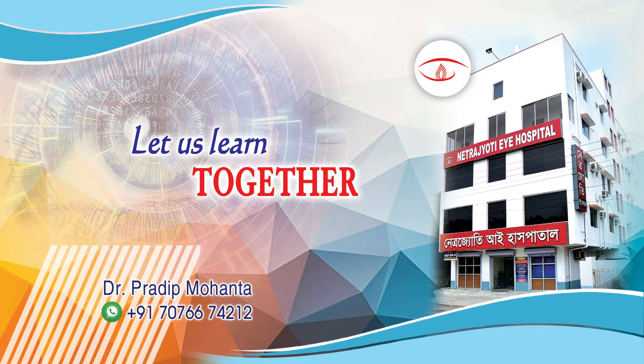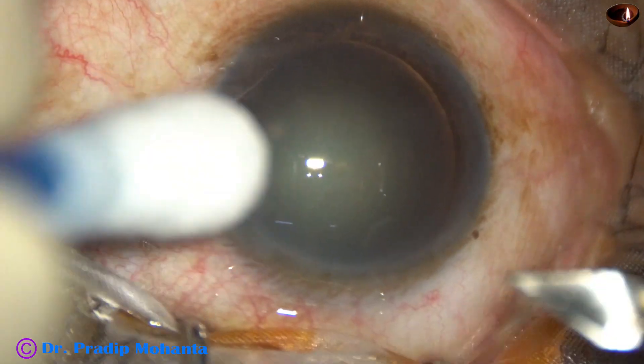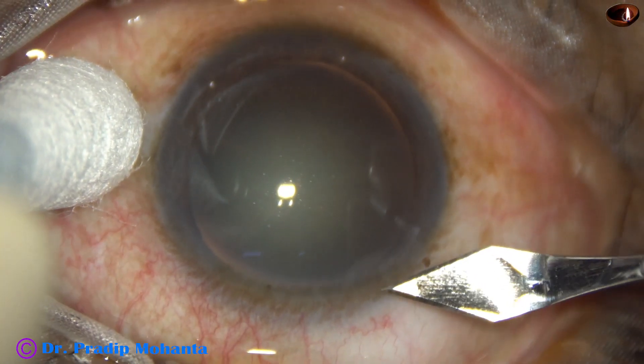Friends, welcome to my workplace at Ranakhat, West Bengal, India. Let us observe the stop-and-chop technique of phacoemulsification through this video.